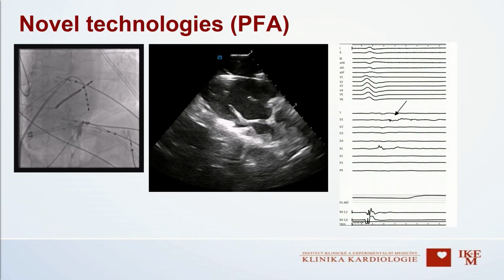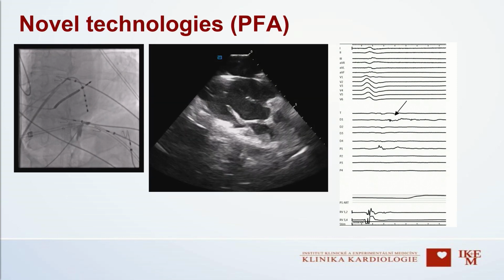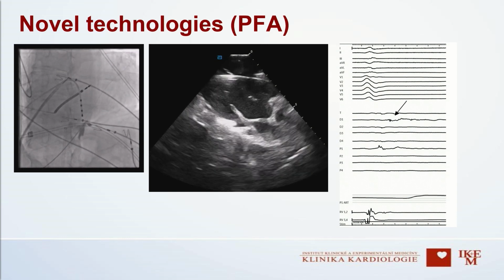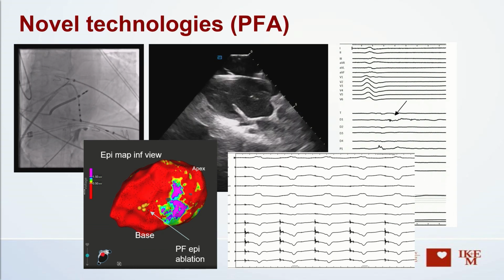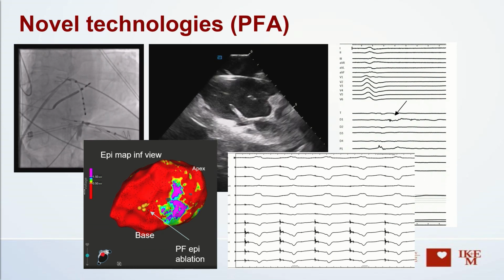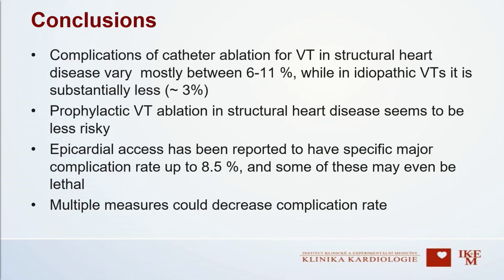Maybe new technologies like pulse field can do a good job. This is one of our cases which Peter did, and you see here the Sphere-9 catheter epicardially, and you can do epicardial ablation even if you are close to coronaries, maybe that would increase safety.